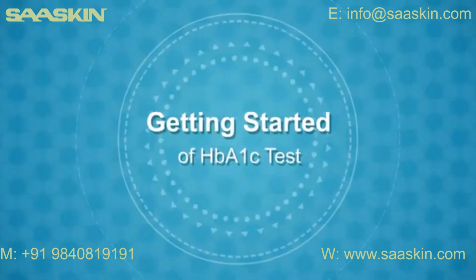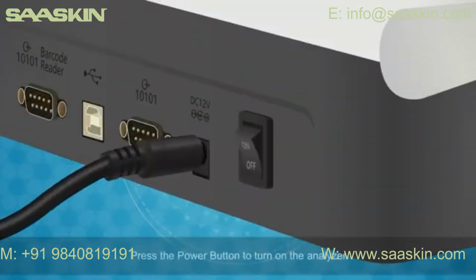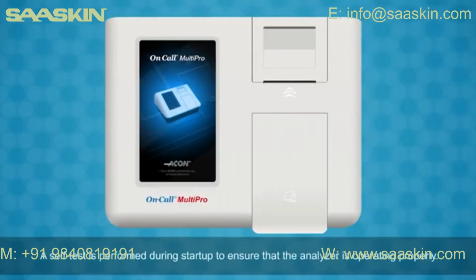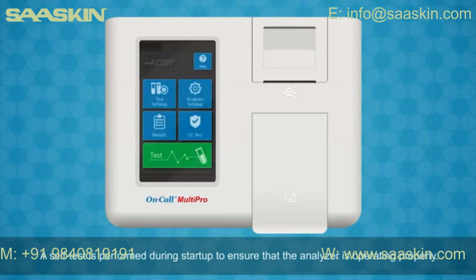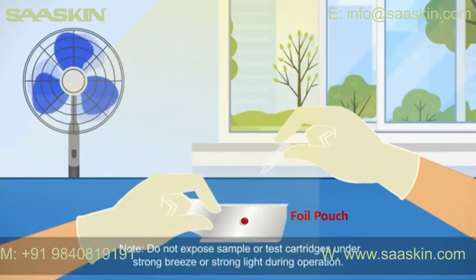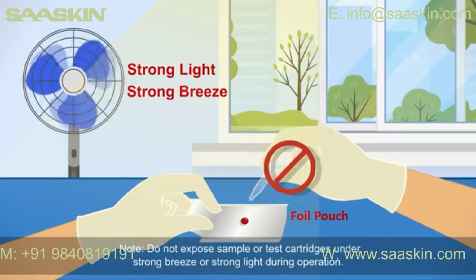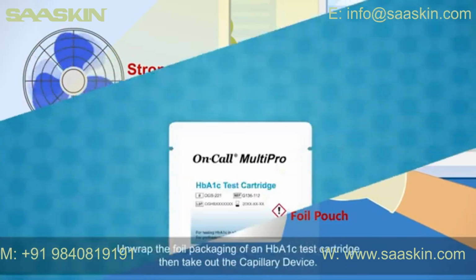Getting started of HbA1c test. Press the power button to turn on the analyzer. A self-test is performed during startup to ensure that the analyzer is operating properly. Note: do not expose sample or test cartridges under strong breeze or strong light during operation.